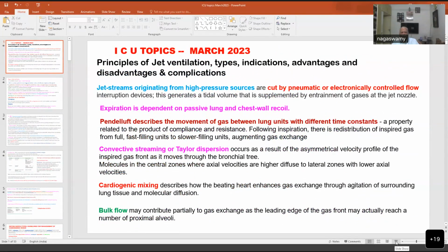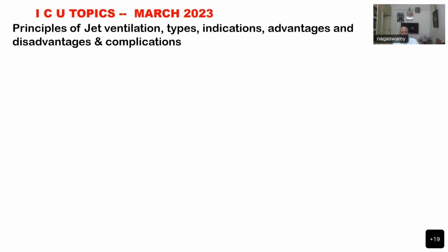And as you mentioned, you have to have an ABG line to measure the carbon dioxide level rather than depend on the EtCO2 for these cases. So you can maintain the anesthesia with TIVA for these cases and then deliver the jet ventilation. And depending upon the EtCO2, PaCO2 value, you can decide the duration of surgery and indicate to the surgeon how long you can proceed and complete the surgery within the available time.